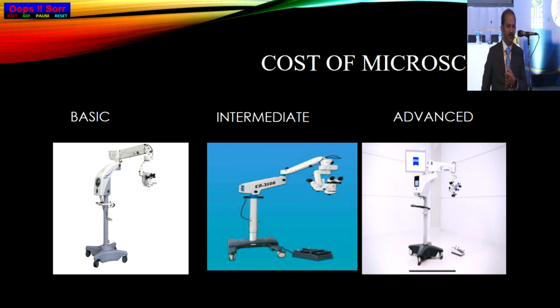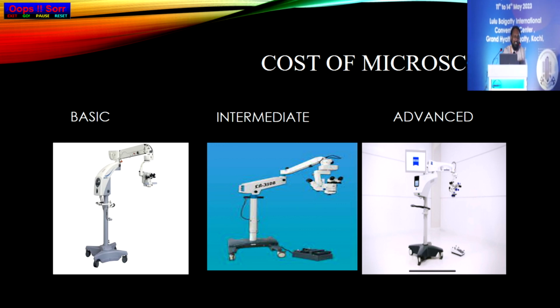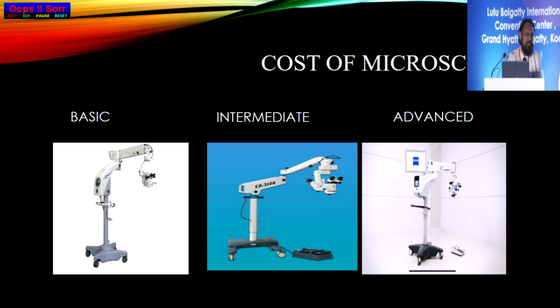Okay, so ma'am's question is, is it better to buy a second-hand, higher-end equipment or go for the lower-end, newer ones? That's a $1 million question. I think, with my experience, whoever is starting off practice, go with the new ones. Don't get tempted with the refurbished ones. It's the same as cars, because you don't know how the other person has used it. It is not according to the number of years. It doesn't mean that a 3-year-old microscope is going to be better than a 7-year-old microscope.